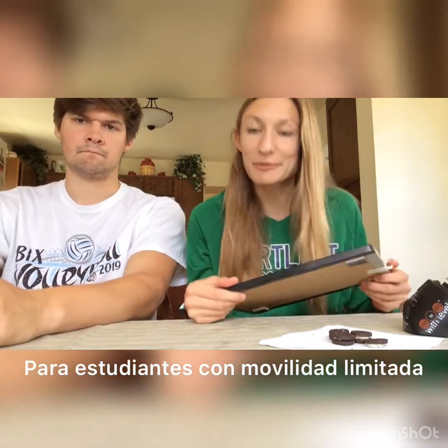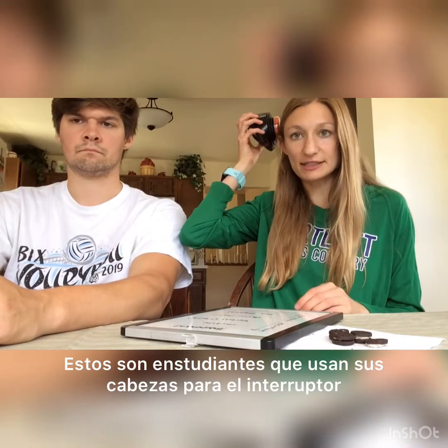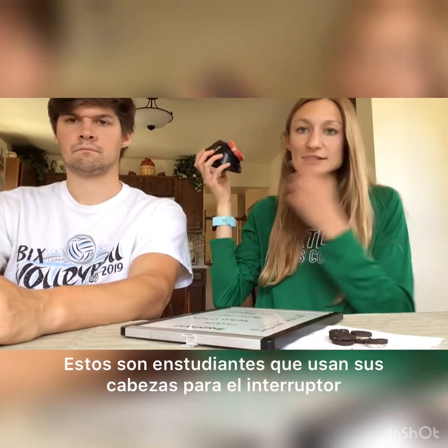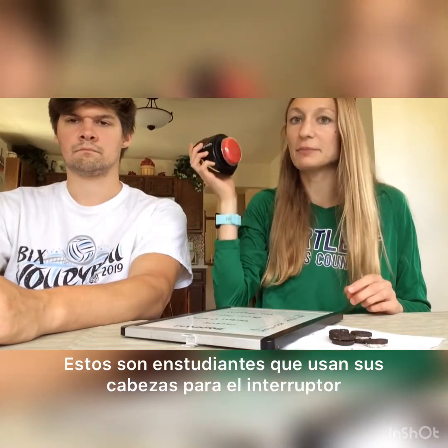In this clip, I'm going to show you how to use a prompt hierarchy for your student who may have limited mobility of their hands and arms. So these are for our students who use their head to activate the switch. When you place it here, they're able to hit it with their head, either on the right side, the left side, or placing it in the back, whatever works best for them. And you can ask me or one of their classroom teachers what they usually do at school for that.